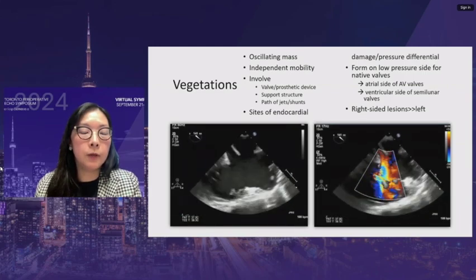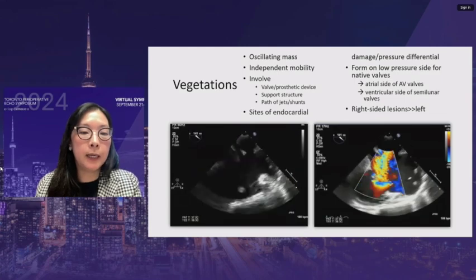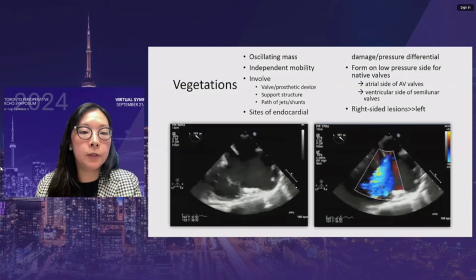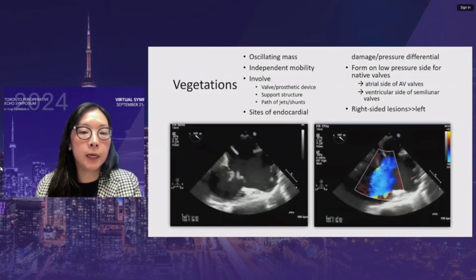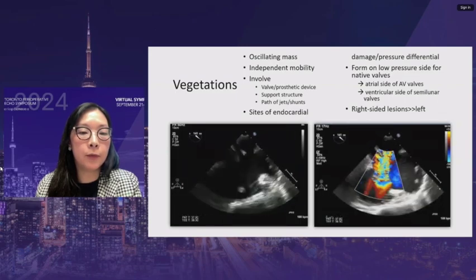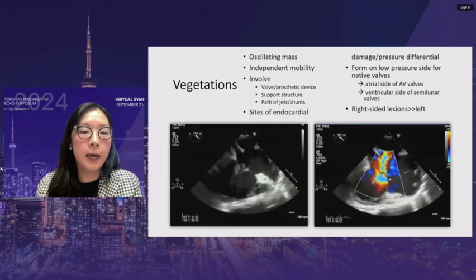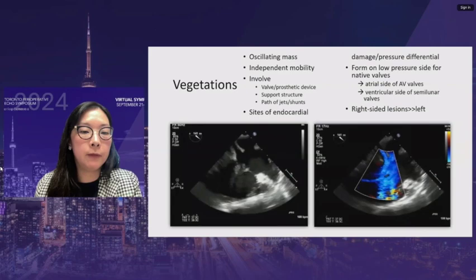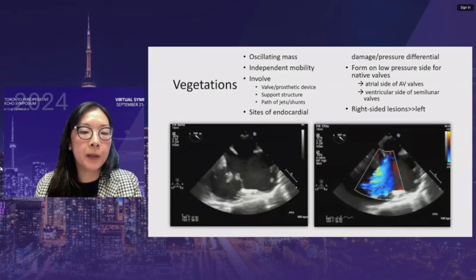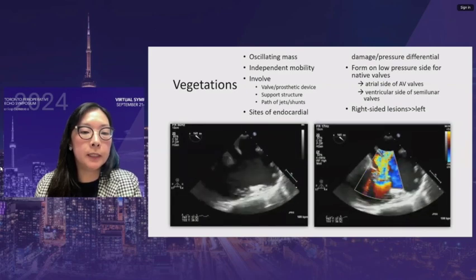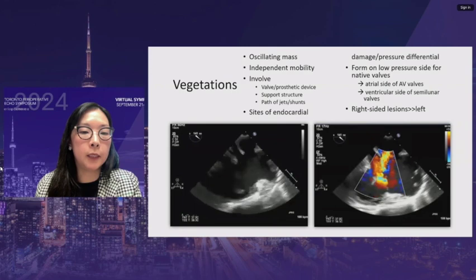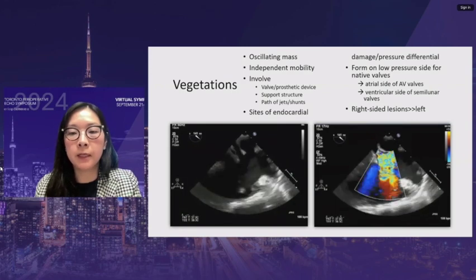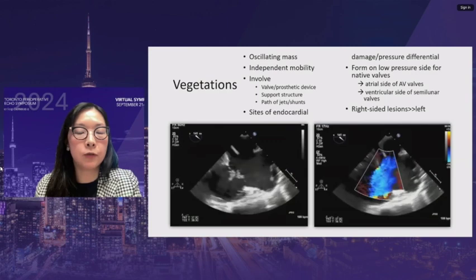A tricuspid valve in a low esophageal view — almost like a reverse four chamber with the coronary sinus visible — shows both posterior and septal leaflets. There is a highly mobile vegetation on the posterior leaflet with a flail, and a less mobile lesion on the septal leaflet. There is also a large atrial septal defect and significant tricuspid regurgitation.